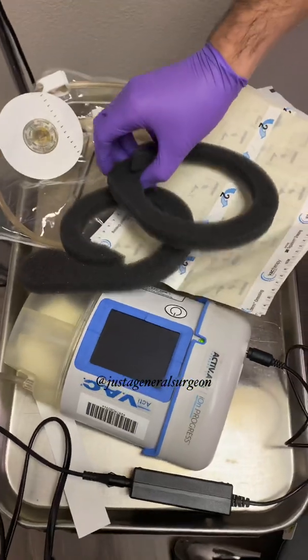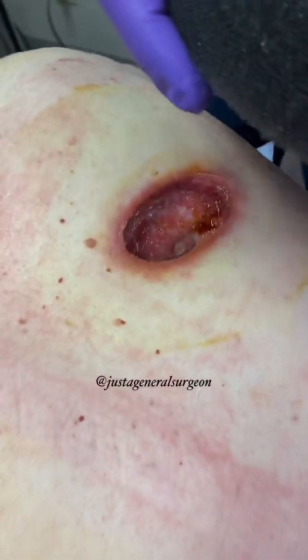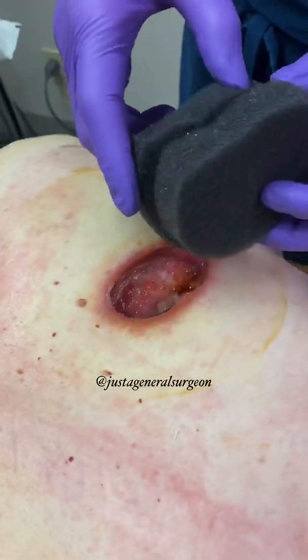These are all the pieces for the wound VAC, which we'll show you how to do the wound VAC dressing changes here. This is the black foam that we're going to insert into the wound.